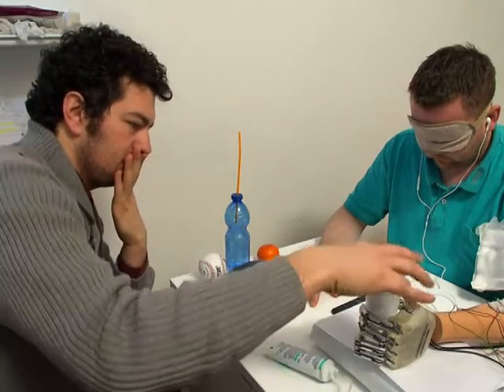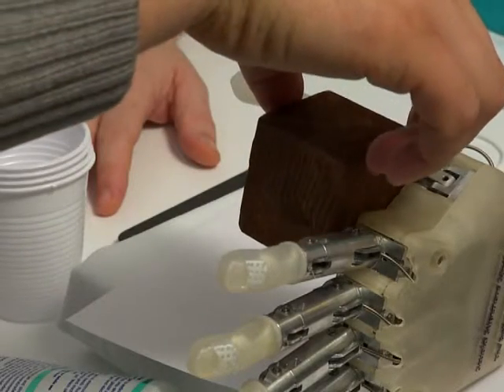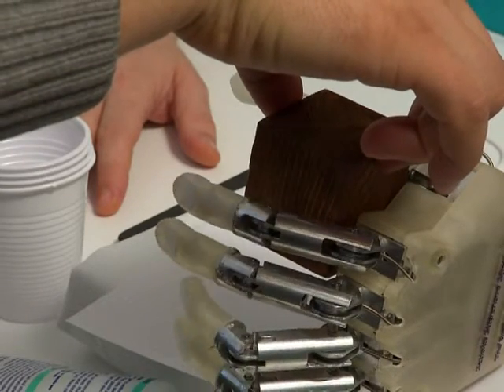Medium. The first time they turned it on and we worked with the new hand, it was amazing because suddenly I could feel things that I haven't been able to for so many years. And it was a kind of — you can feel round things and hard things and soft things. That was quite amazing.